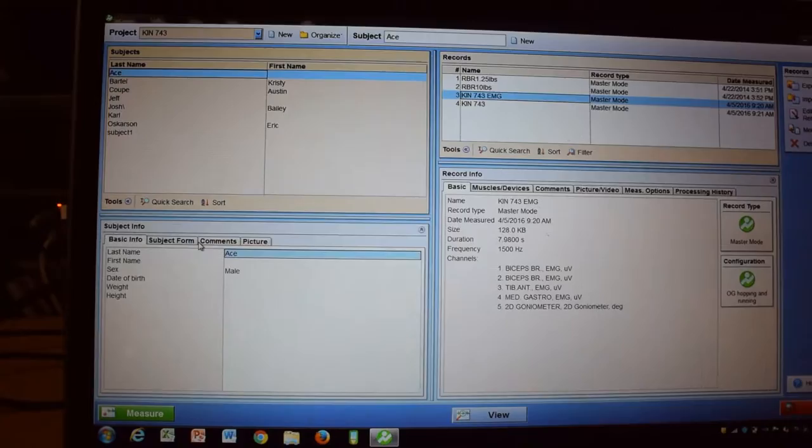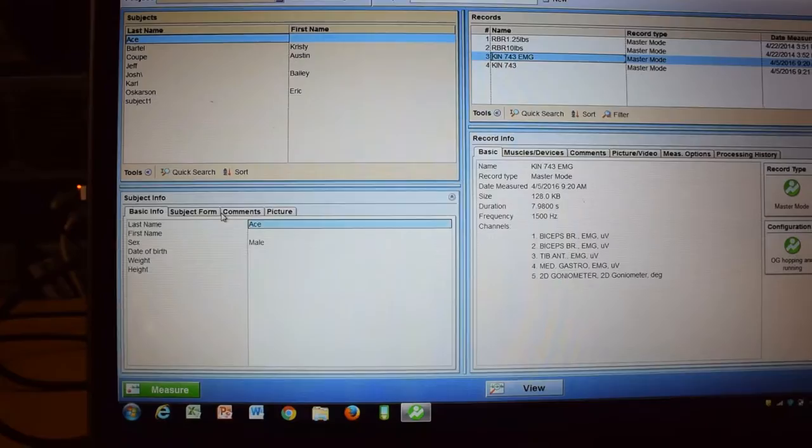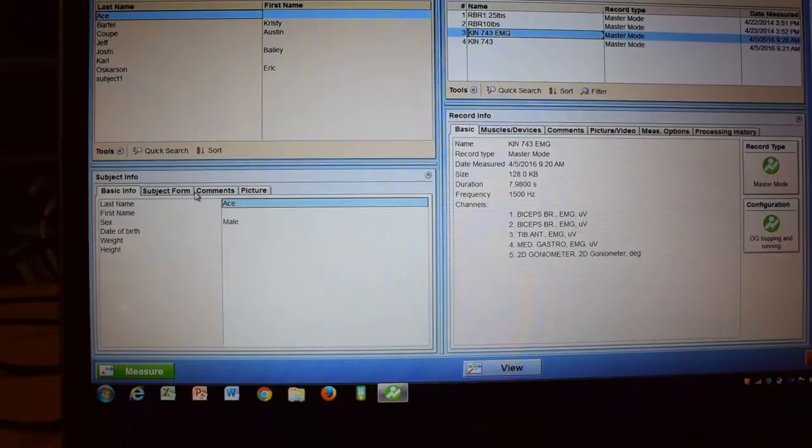Alright, so since we had some issues on Monday recording some EMG data in class, I wanted to visually show everyone how to collect some EMG data in case you are interested in doing so. So the first thing that you've got to do is you will open up the MyoResearch XP Data Acquisition and Video Edition.